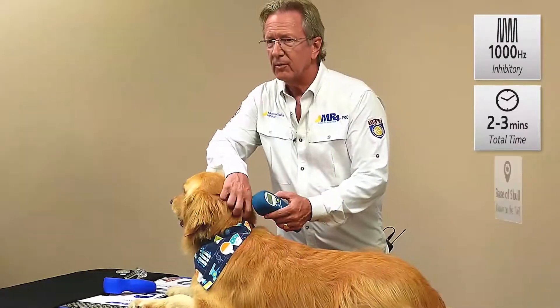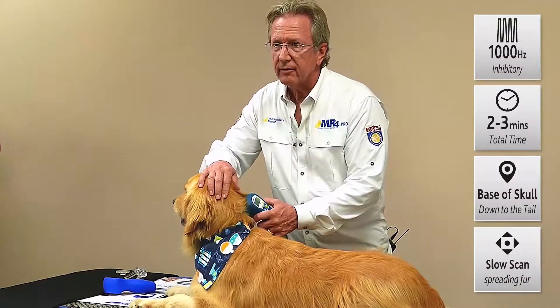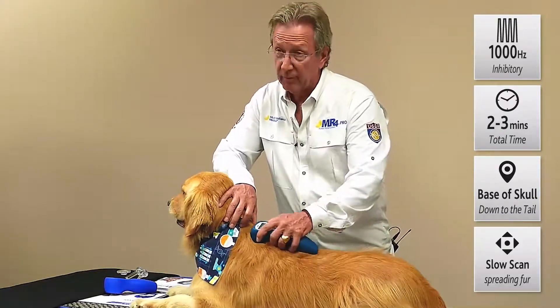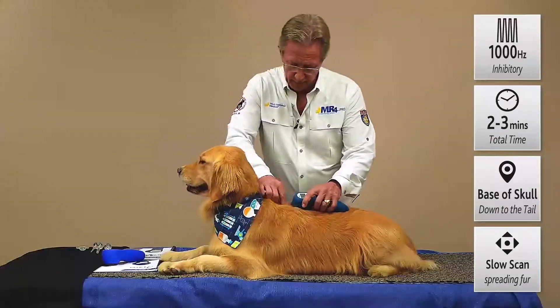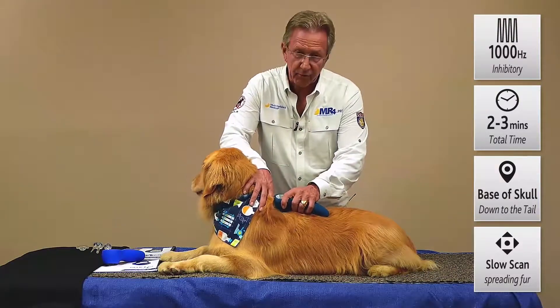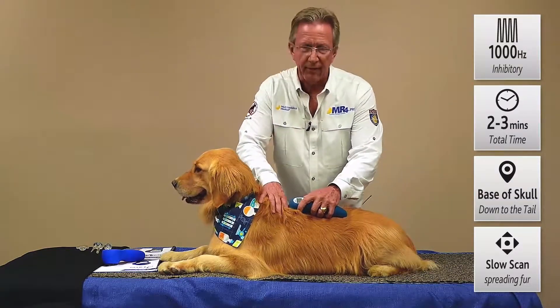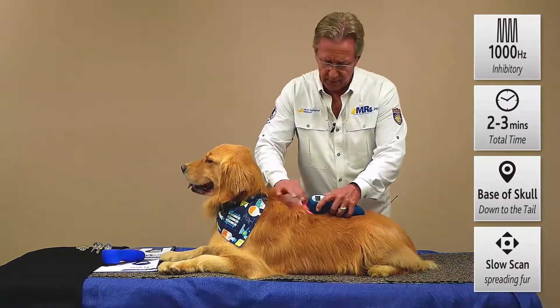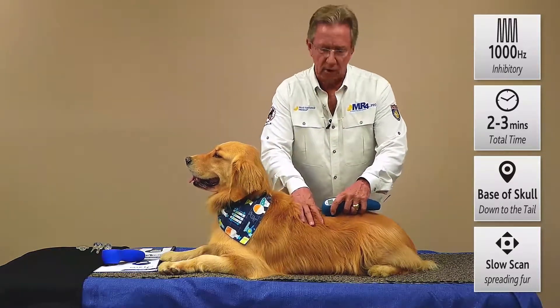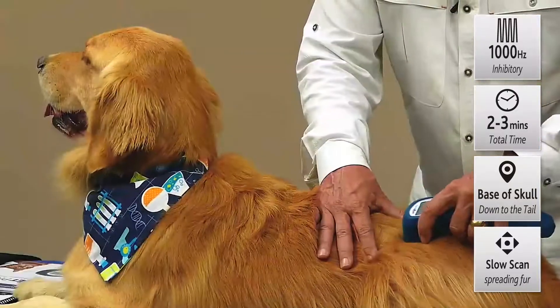You can see the visible red, but along with the visible red at 640 nanometers is the 875 broadband infrared and the 905 nanometer superpulse laser. We'll just spread her fur as we go down to get that emitter closer to the skin. This unwind protocol at 1000 Hertz is great for causing a systemic release of endorphins, which gets the animal nice and calm and very comfortable.